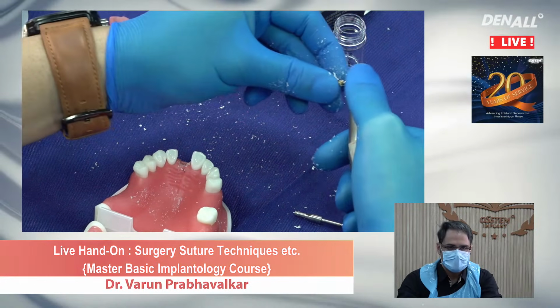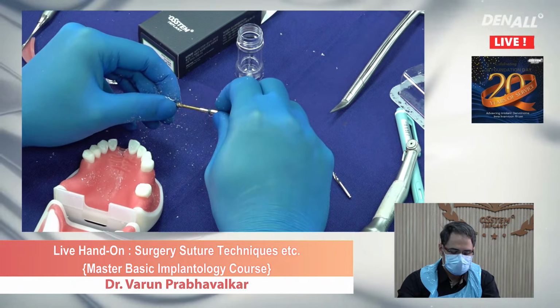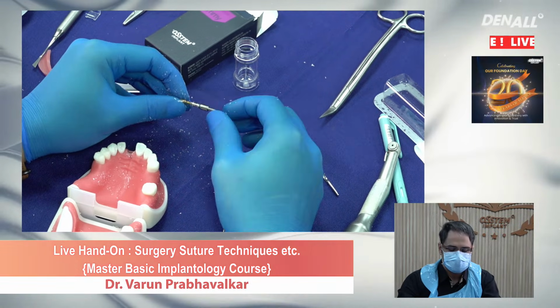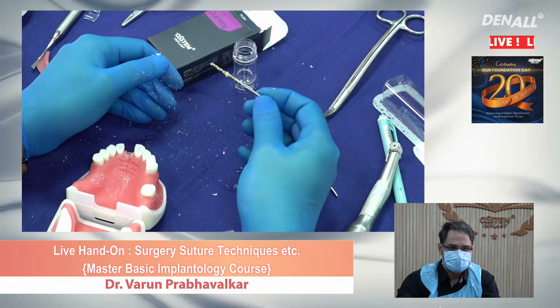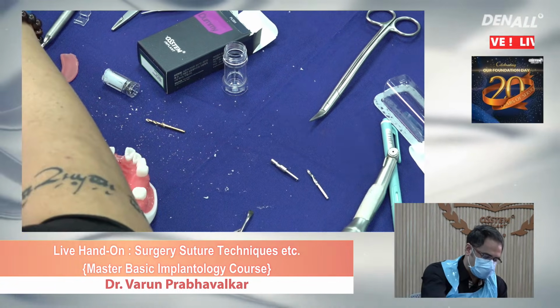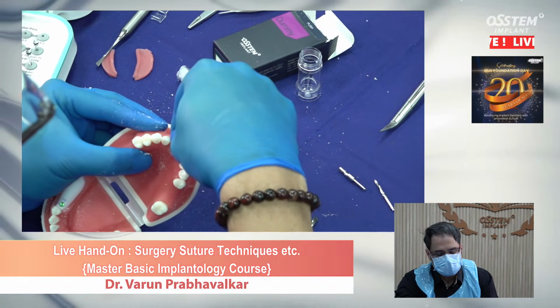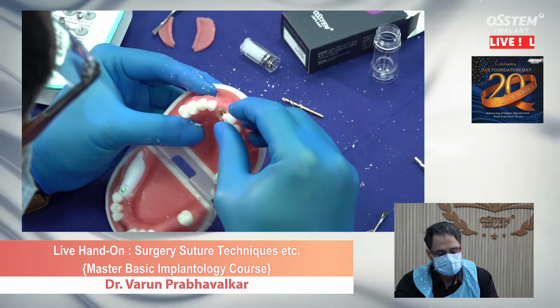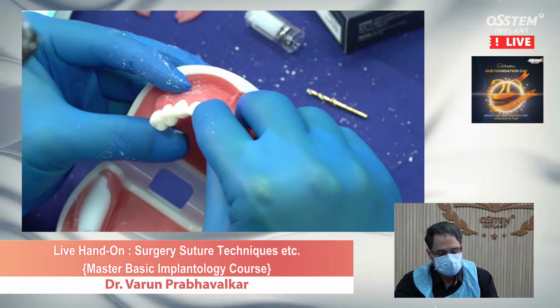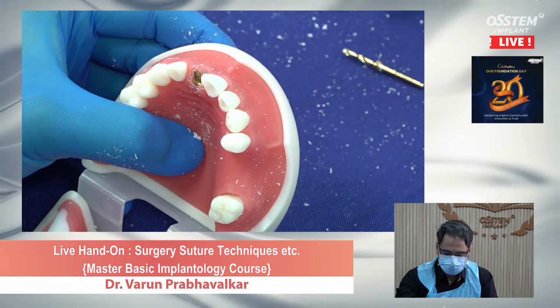Okay? The drill extension is going to increase the height. It's very simple. Take your drill and put it on the drill extension. As simple as that. See the length of the drill now. Anyways, so we have achieved the osteotomy. I will try to place a paralleling pin because it's too deep, but this is what we are getting. It's getting pushed by the palatal soft tissues.